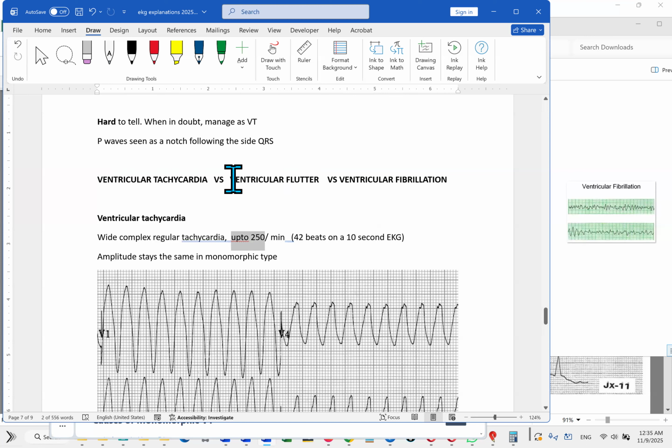And in reality, you will never ever see ventricular flutter because by then the patient is so unstable, they are only seconds away from ventricular fibrillation. So usually, if you are seeing the patient in ventricular tachycardia and you're starting to treat, cardioverting or whatever, at any moment they will go into ventricular fibrillation. That brief transitional time, few seconds that you may actually see flutter, is more of an academic thing. You will never actually see it. But for academic purpose, you have to remember ventricular tachycardia rate exceeding 250 is flutter.